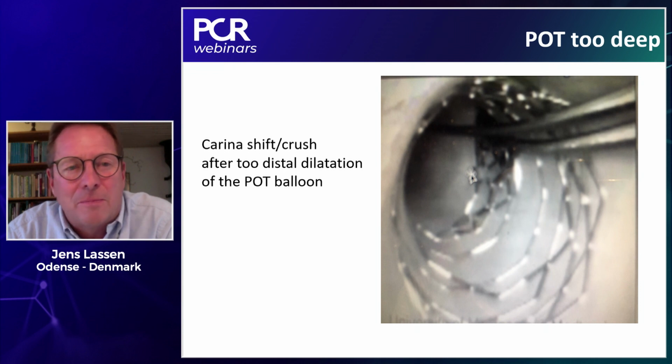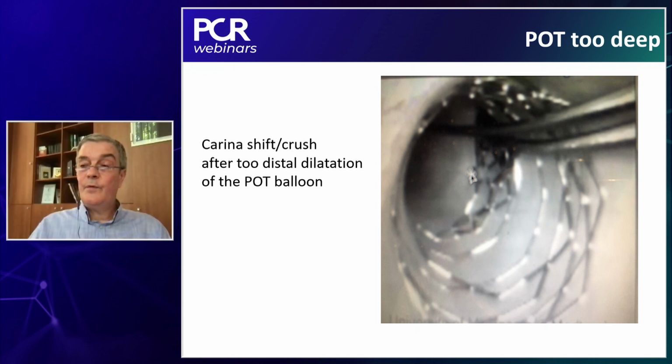Yes, can I just interrupt you for a second? I think a very important question came from Dr. Manoukian. Some operators remove the side branch wire before POT. Is this acceptable?